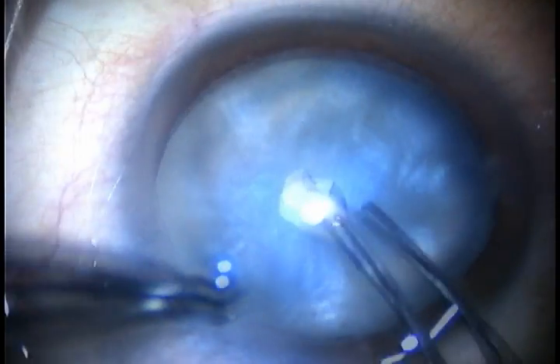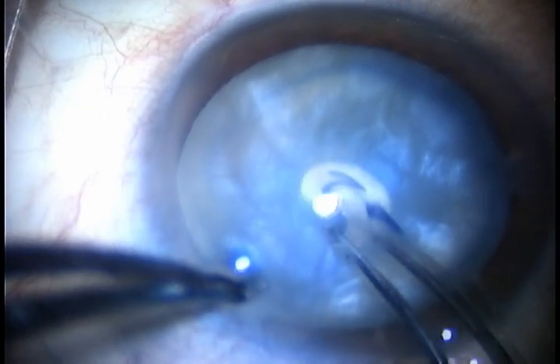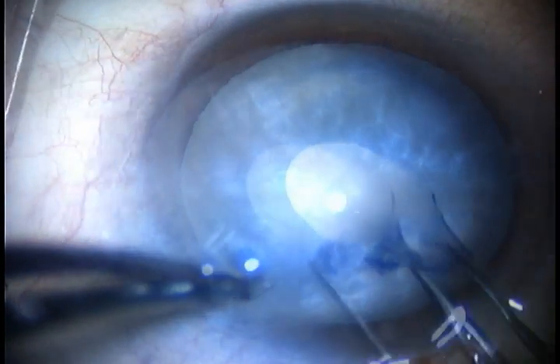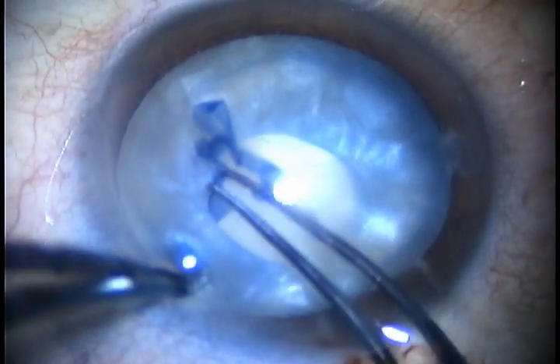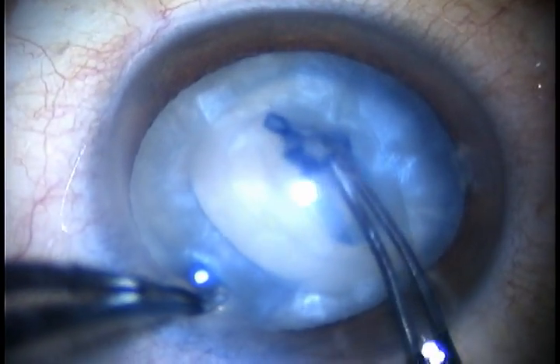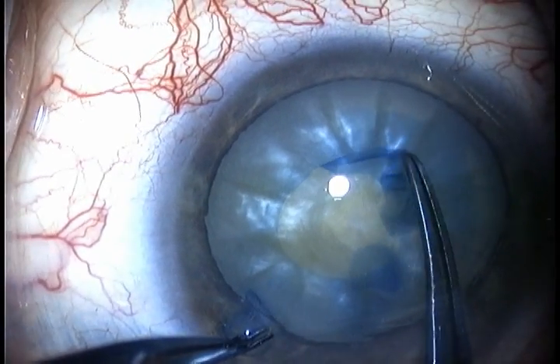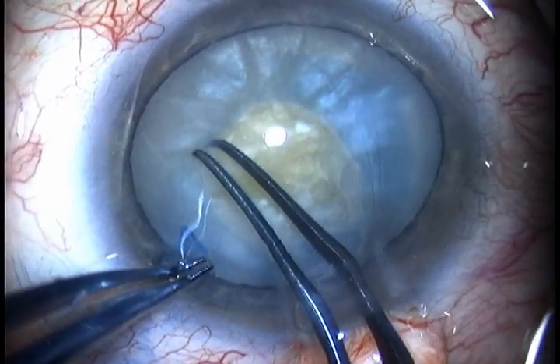Rule number three is related to the opening crease of the anterior capsule. We should never let the capsular opening move towards the zonules. For that, we should use the technique developed by the Brazilian Israel Rosenberg — the snail-like capsulorexis. This technique provides a very fragile flap which can easily be redirected in case an opening tends to go towards the periphery. With this technique, we can usually get a complete opening of the capsulorexis to 5 mm even without clearing the posterior part of the lens. The best bet is to do a small rexis of about 3.5 mm with the Rosenberg technique and then enlarge it to 5 mm after having voided the liquid from the posterior part of the lens.